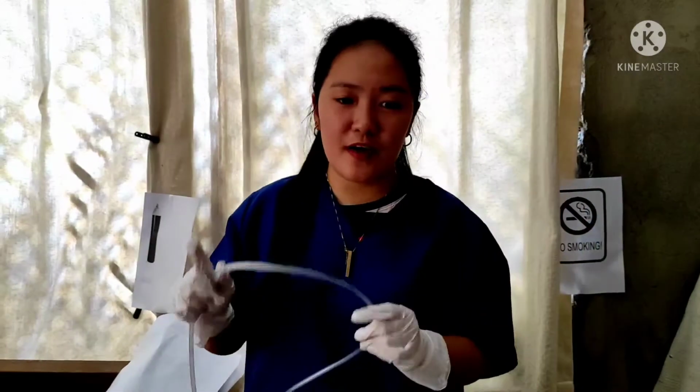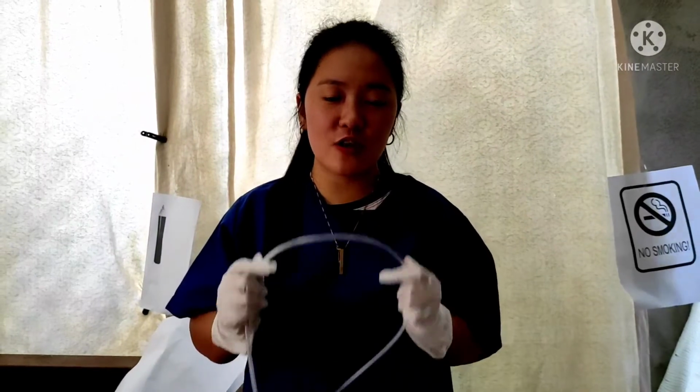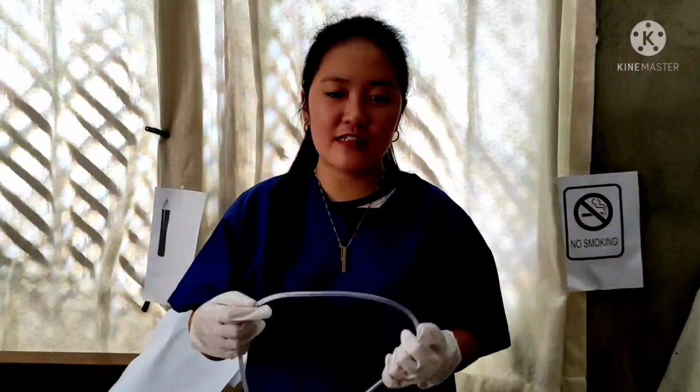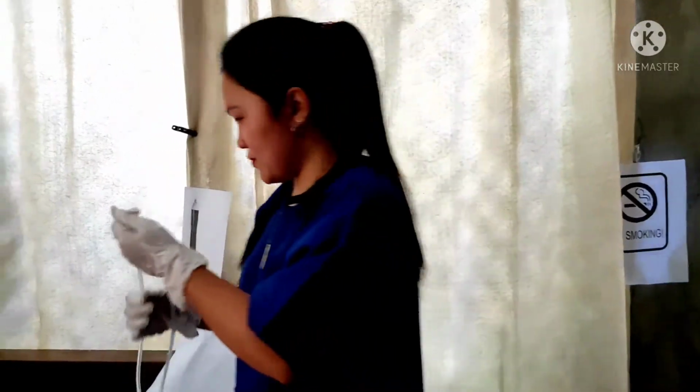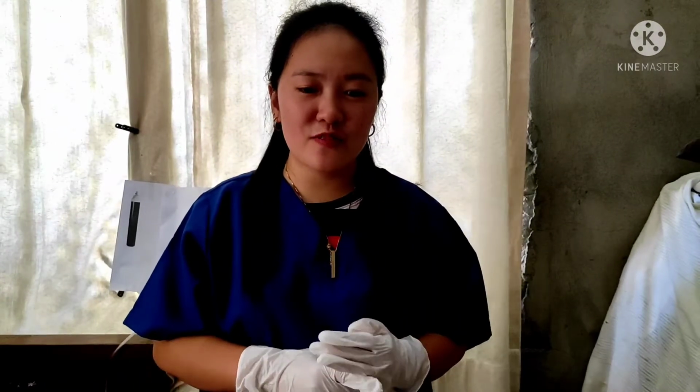Adjust the tubing behind the client's ears and slide the plastic adapter under the client's chin until she is comfortable. The rationale of this: proper position allows unobstructed oxygen flow and eases the client's respiration.